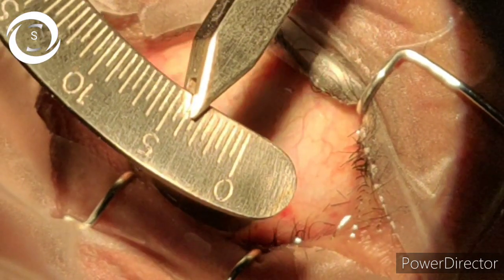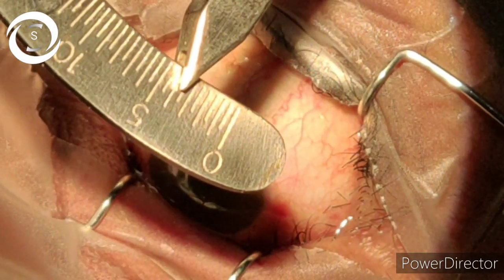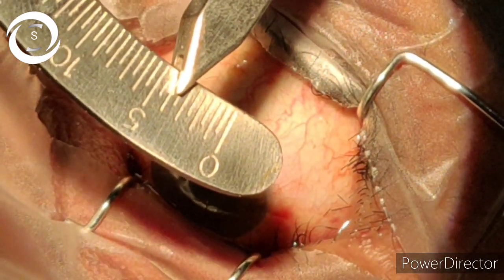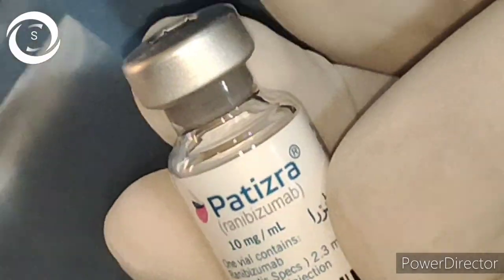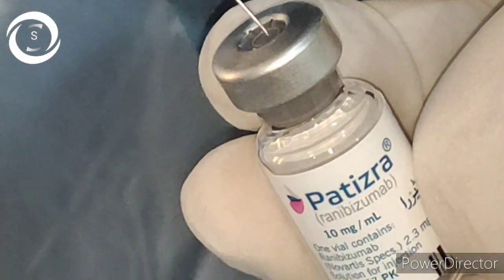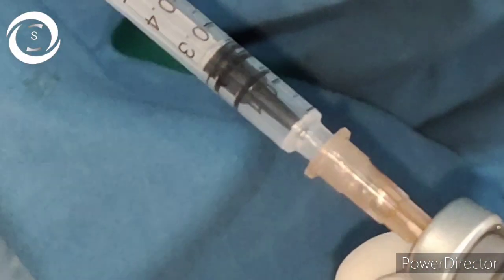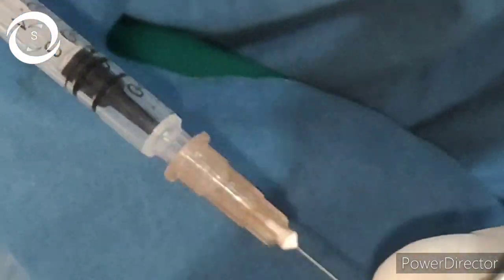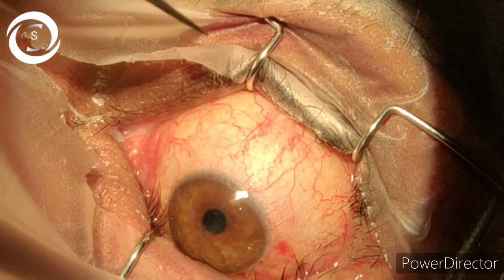Then with a large bore needle like 18 to 20 gauge, you draw the medicine into a 1 ml syringe and then change the needle to 27 to 30 gauge, because large bore needles cause greater vitreous reflux in comparison to small bore needles.